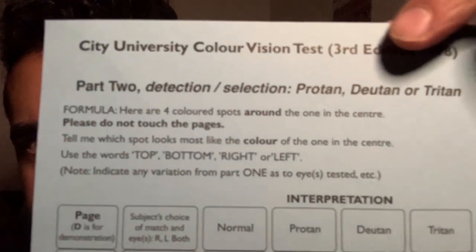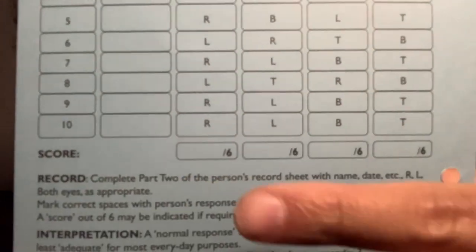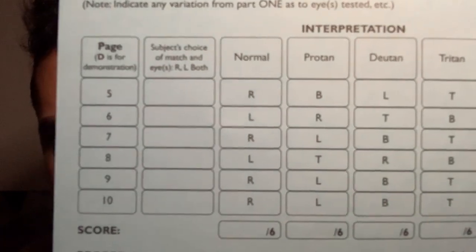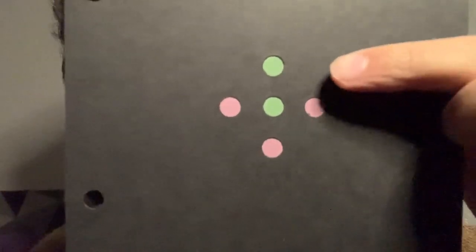That is part one. For part two of the City University test, if someone has failed part one we move on and attempt to classify their colour defect as protan, deutan, or tritan. All answers are recorded and scored at the bottom. The first plate is a demonstration plate: which spot closely matches the colour of the central spot from the four peripheral ones? Everybody should be answering top, as that closely matches the colour of the middle spot — that is how part two works.